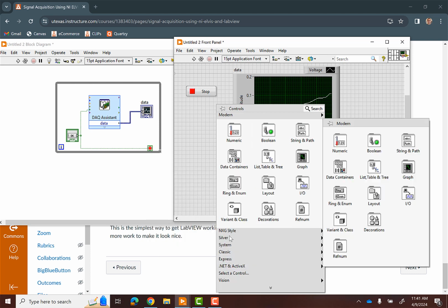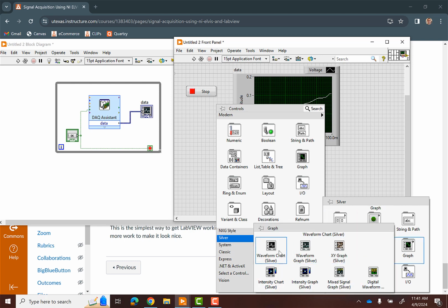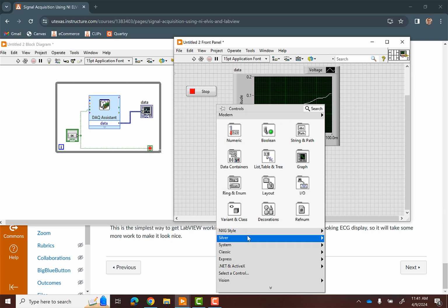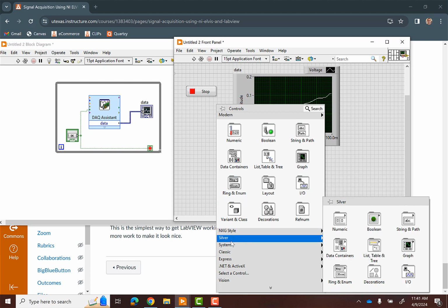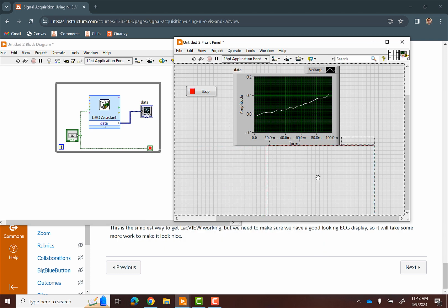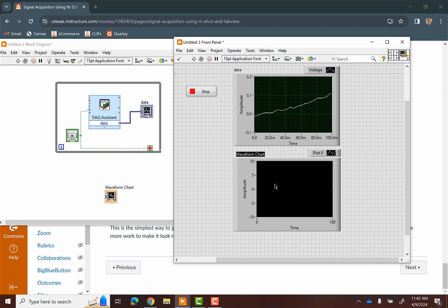I also point out sometimes there's some other styles, right? So I can go to like the silver style and use a graph and do my waveform chart that's silver styled, right? Or there's the classic style graph, again, classic waveform chart. So, you know, whichever style you choose, the NXG style, I have that. You might have some different ones depending on your version of LabVIEW installed, but I'm just going to stick to this. This is the under modern waveform chart. So I'm going to drag that over here. Okay, so you can see it's over here.